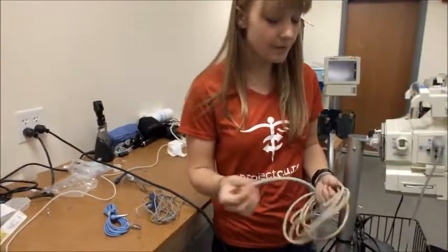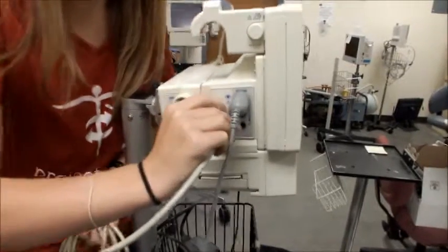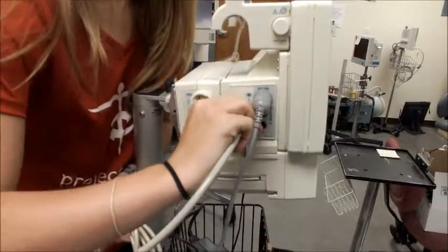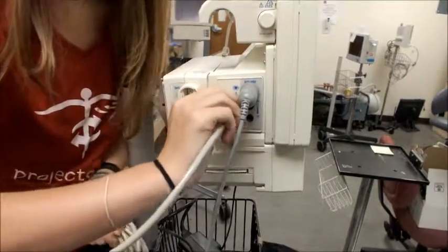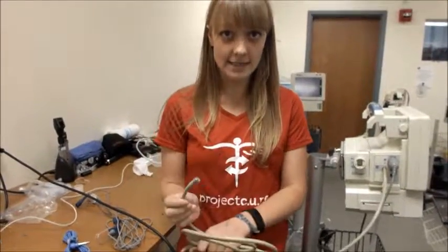Next we're going to try the blood pressure tubing. This blood pressure tubing is a screw-on attachment, so as you can see it fits onto the cord, and we'll be able to attach the blood pressure testing devices to this end.